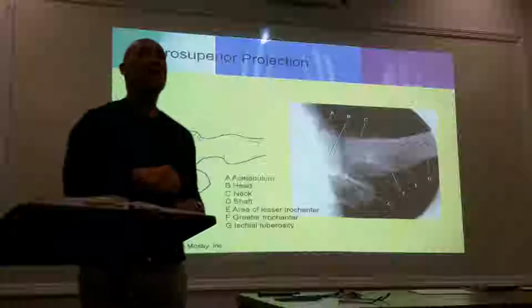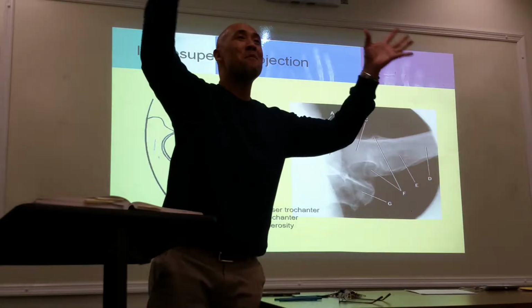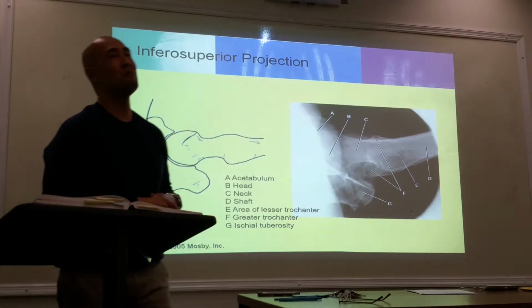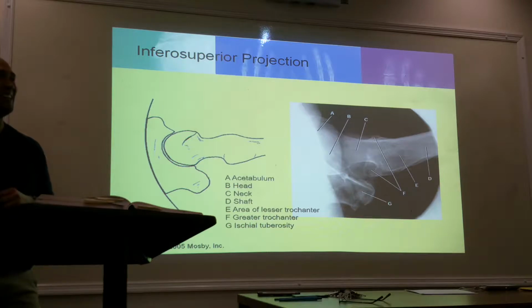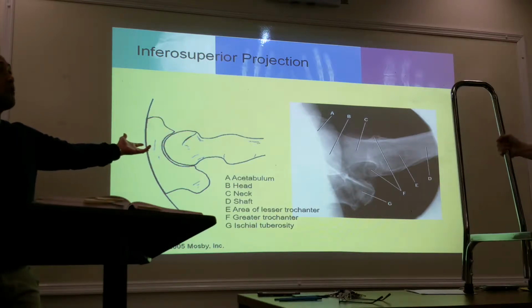It's not trash. The correct term is the Danelius-Miller projection. It's a true lateral. That's all you have to say. It's already in my brain, Doctor. So you perpetuate that. No, I don't have time to do this. I've got like 100 more images to go through.